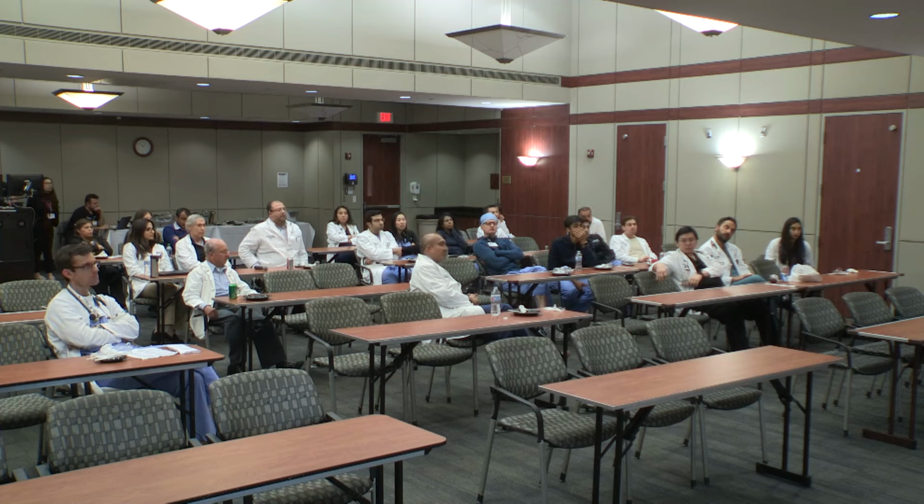So the key for you to take home is the FFR derived from CT. Number one, it is not the same as invasive FFR, and its accuracy is probably less than PET in terms of predicting functional significance, maybe close to SPECT, I think, from the PACIFIC data.